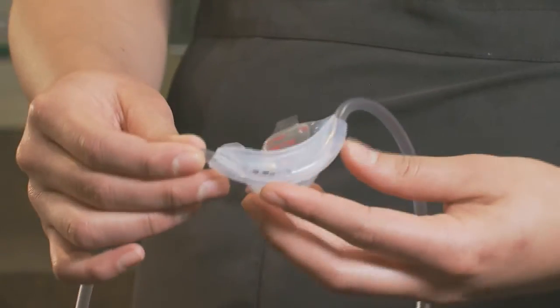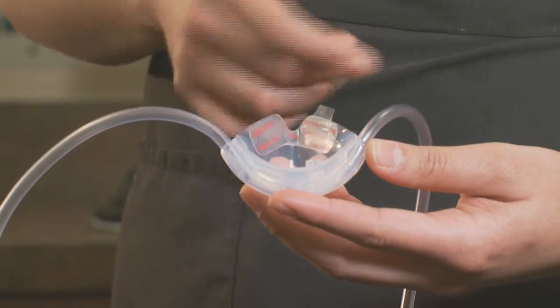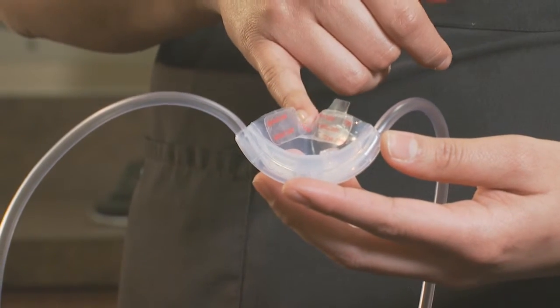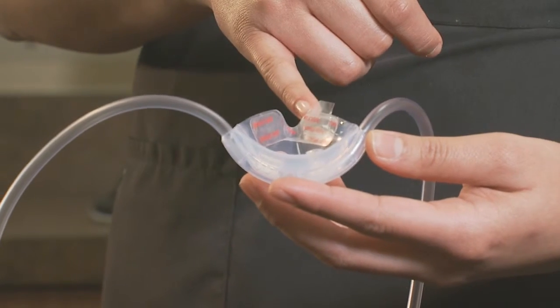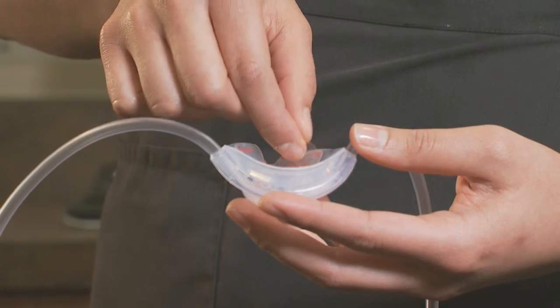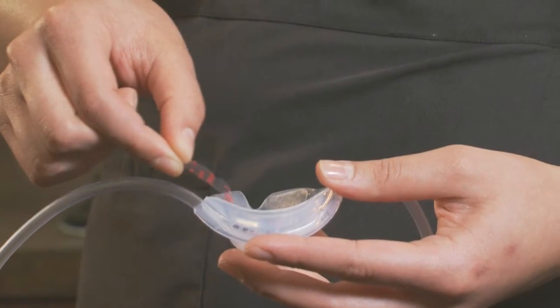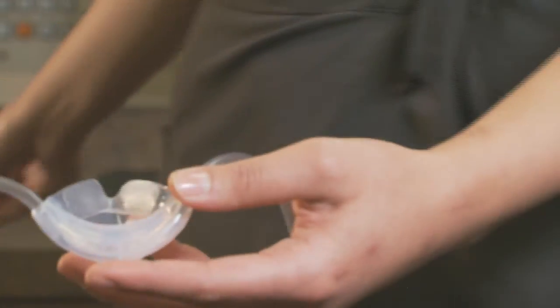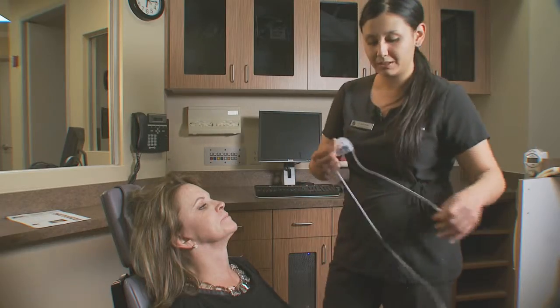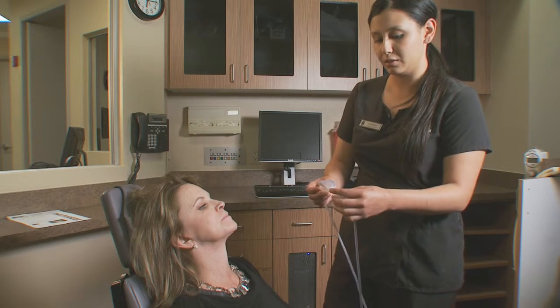On the adhesive of the mask you can see that it's labeled — adult small — and it's also color-coordinated with the words to match the size mask we've picked. When you go to remove the adhesive, use the tab to guide the adhesive away from the mask. Once you've removed that, you can go ahead and dispose of it. When placing the mask, make sure the adhesive is facing the bridge of the nose.